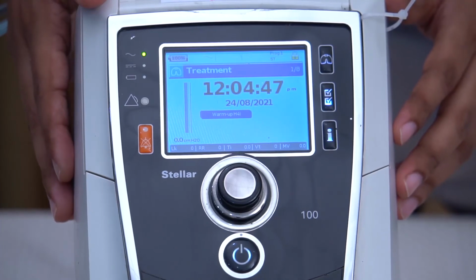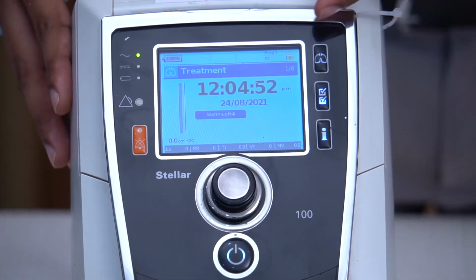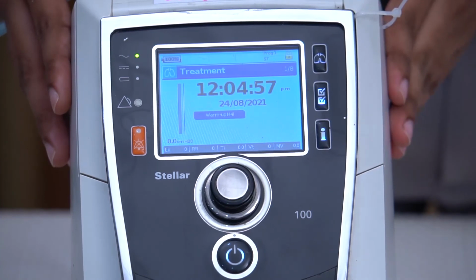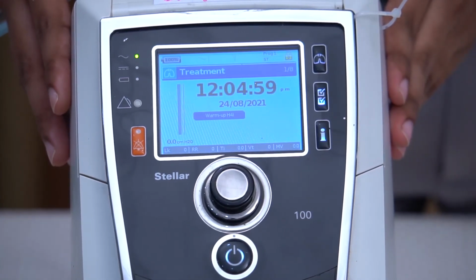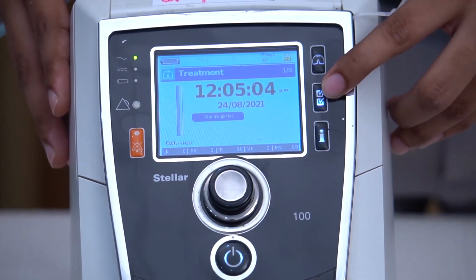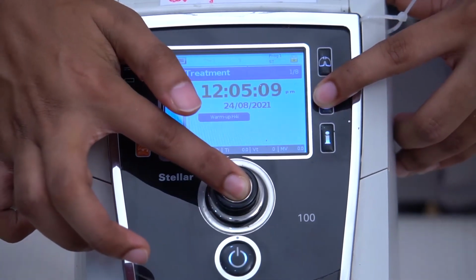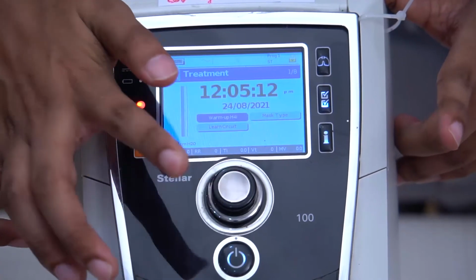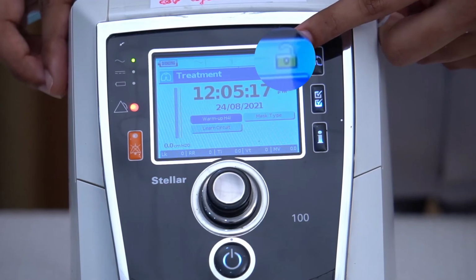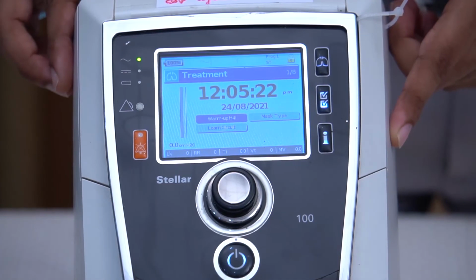Lock and unlock the main unit. Once the machine is on, you will see a locked padlock sign in the right upper corner of the main screen. You are not allowed to change settings unless you unlock the unit. To unlock the unit, press the right middle button, which has two tick signs, and the middle knob together for a few seconds. Then the unit will unlock, and the locked padlock sign will change to an unlocked padlock sign in the right upper corner of the screen. Now you are permitted to change the settings.